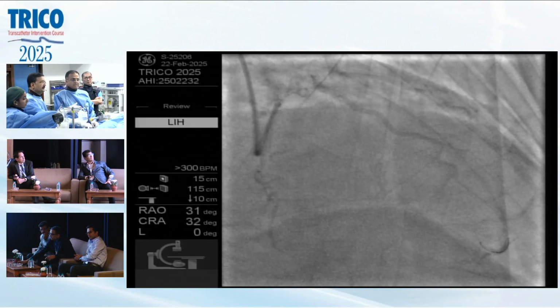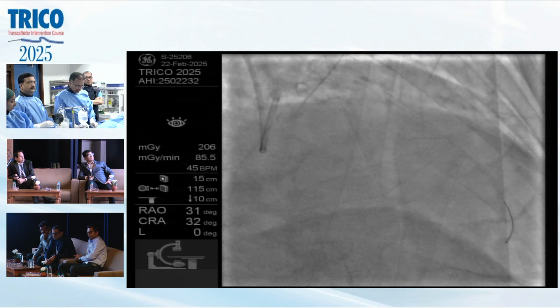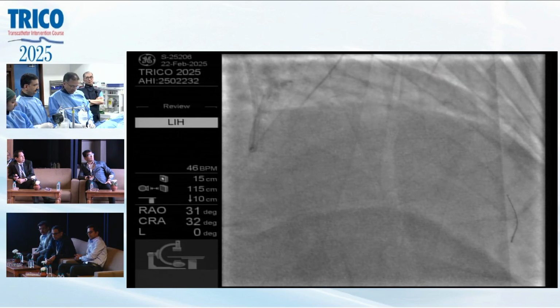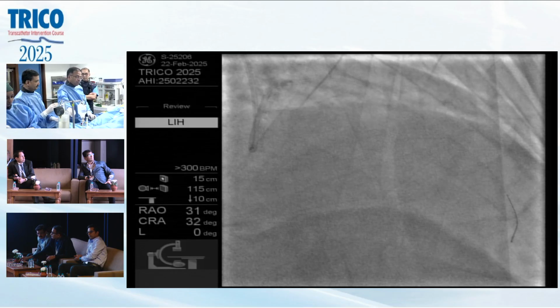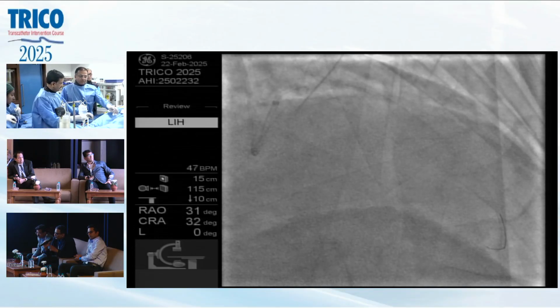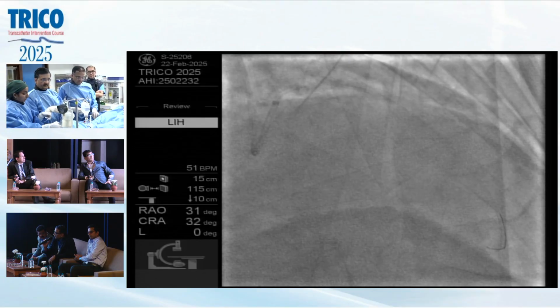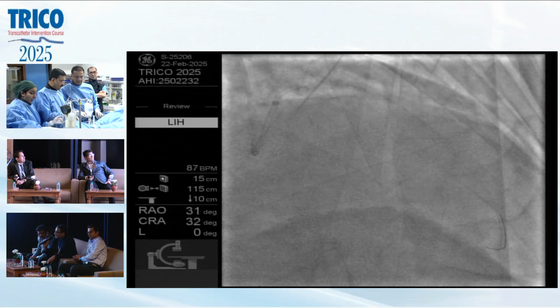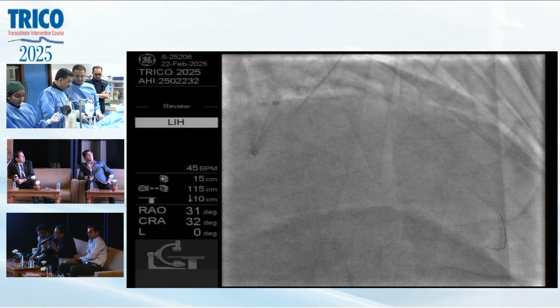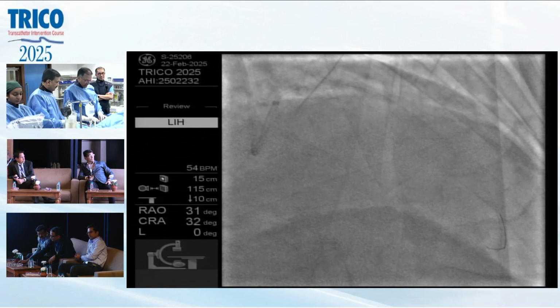Let me fix the distal wire. It's okay, good enough. One minute. Make sure it's okay. What did you say? I said a good way to get some more information is to leave the balloon there in the stented segment and do a stent boost. Sometimes with so much tissue, you can't see what's happened to the stent even with the OCT. The stent enhancement technique gives you a good idea before you start. True, good point.